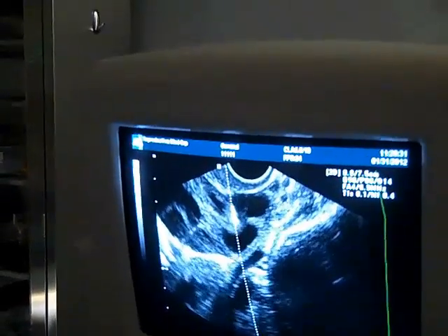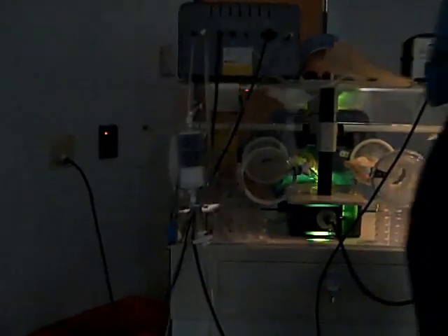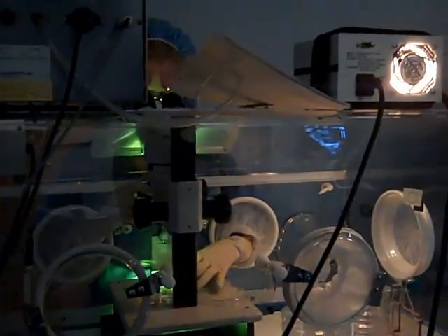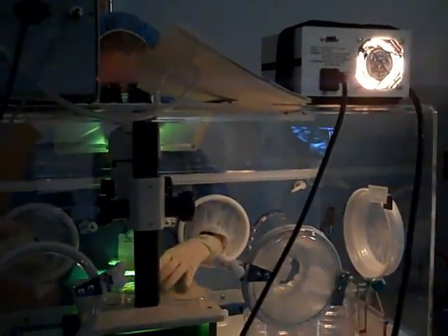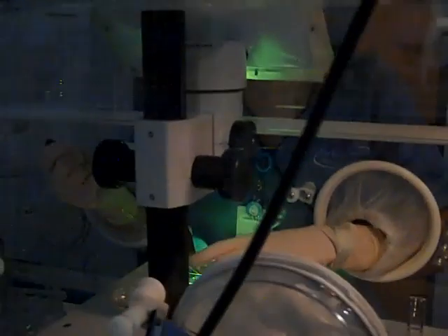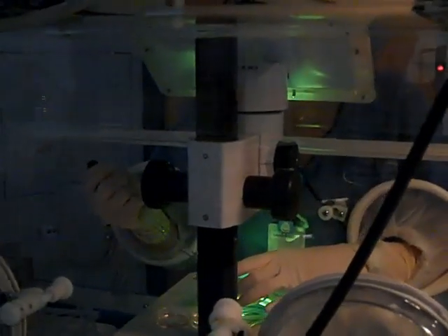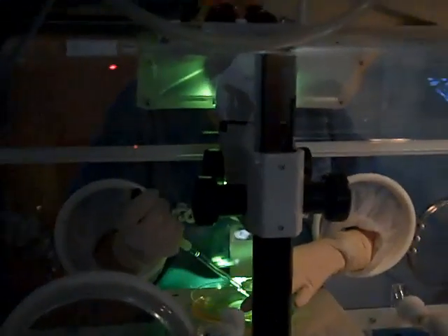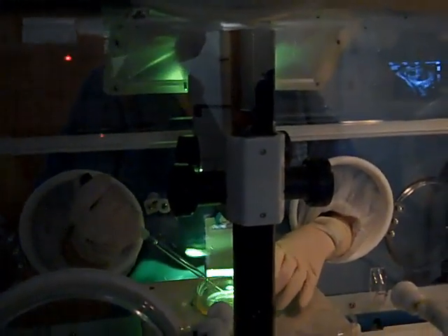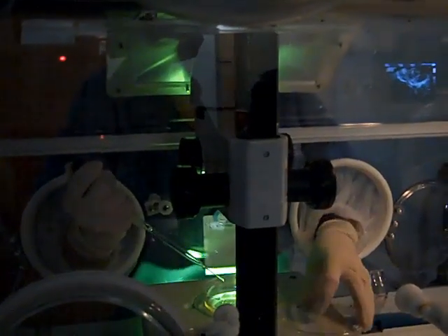Once the test tube is filled with fluid, it's brought to a special chamber where it's examined by our embryologist to determine if there is an egg. Hopefully Laura will be identifying an egg within the chamber shortly and we will have Liz's first egg. We had one, two in the first — so that was great. We got two eggs from two follicles, which is wonderful.